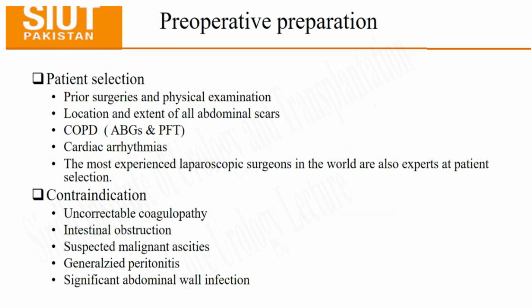So it's just like a car. When you're learning car driving, the other person has got all the controls of the car as well. So if you're not doing properly, he will take over. So there's a primary and a secondary console, and the primary console has got all the powers to take over from the secondary console. So if the surgeon who's operating is doing some mistake or anything, then the primary surgeon takes over. So that is a very good modality for teaching and training robotic surgery.